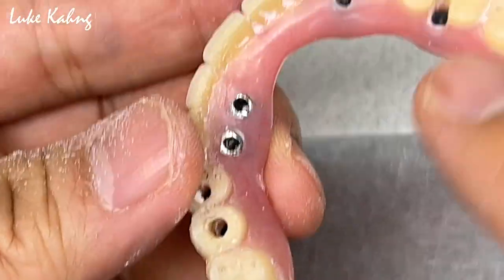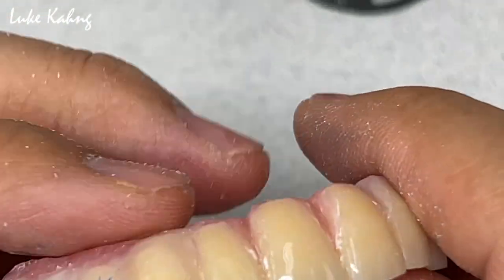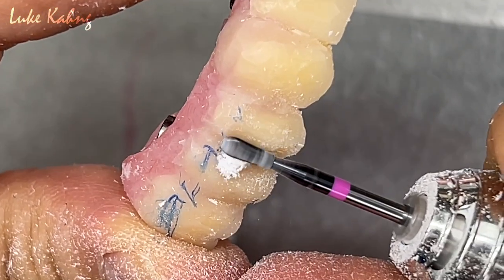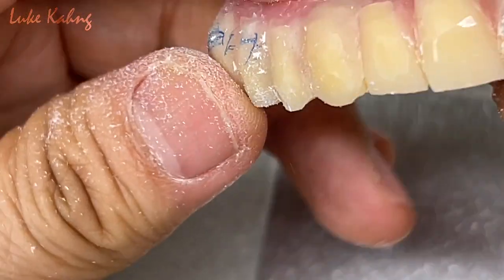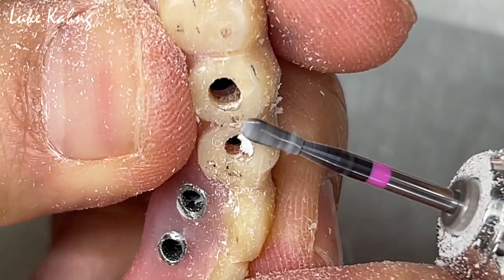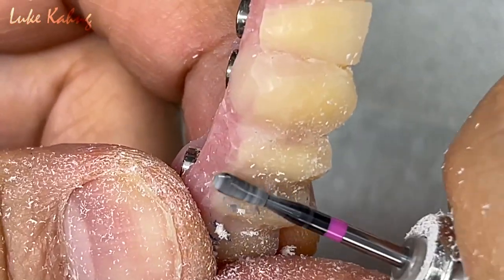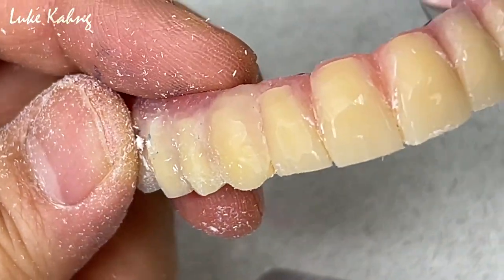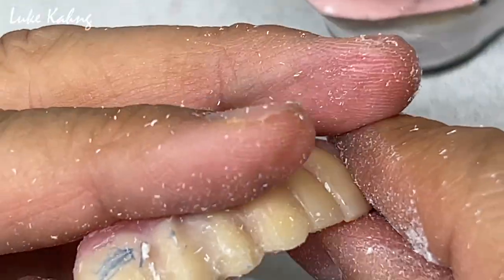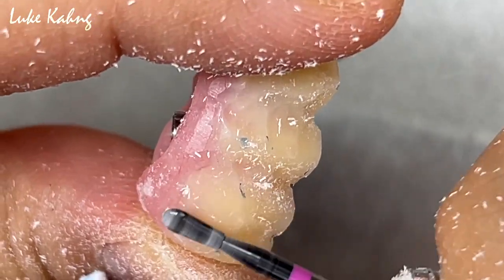We can cut it, especially here. Tooth contour — tooth contour for that. After I modify, either I can do it by hand here, or I can do it in design. Usually we do designing — that's why I can show them a lot of design videos. It's like people don't like that, but either hand touch — analog — or in computer, I have to touch it. Like I said, this is bad. Let's clean it.